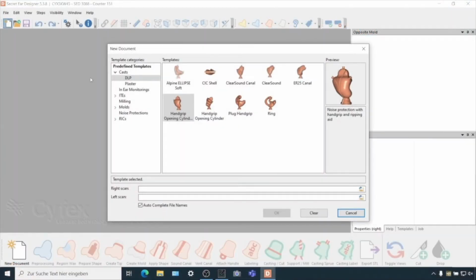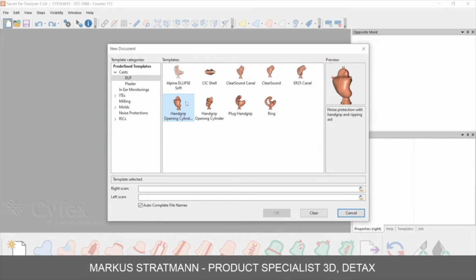So we'll start at first with the Cyfex software. I will show you how easy it is to set the crush line. We will start and open the Cyfex ear designer. We will open a new file to make it easy, because this is not a modeling workshop on how to model molds and other parts. Today we will only show you the workflow for Cocoon.